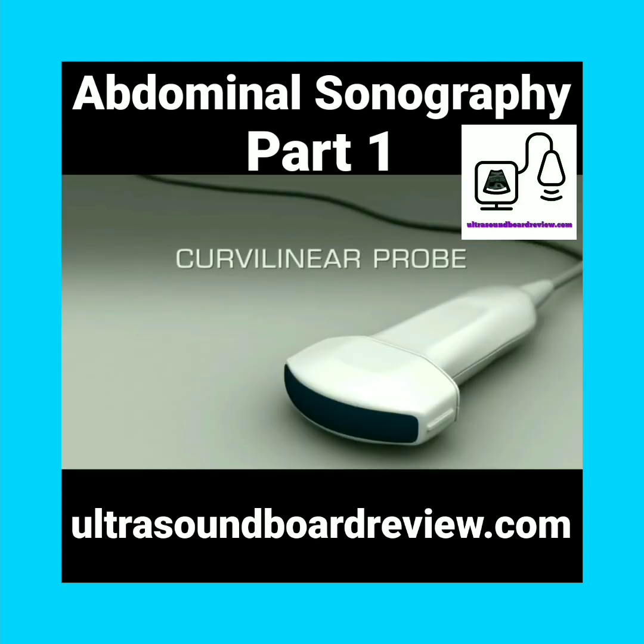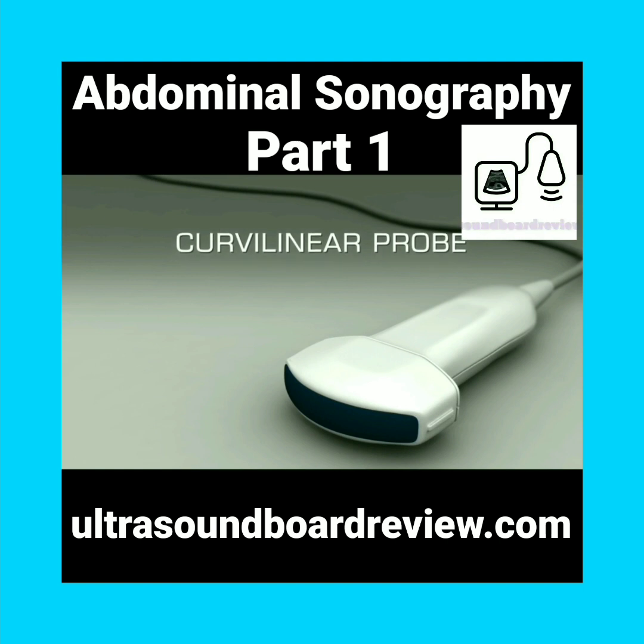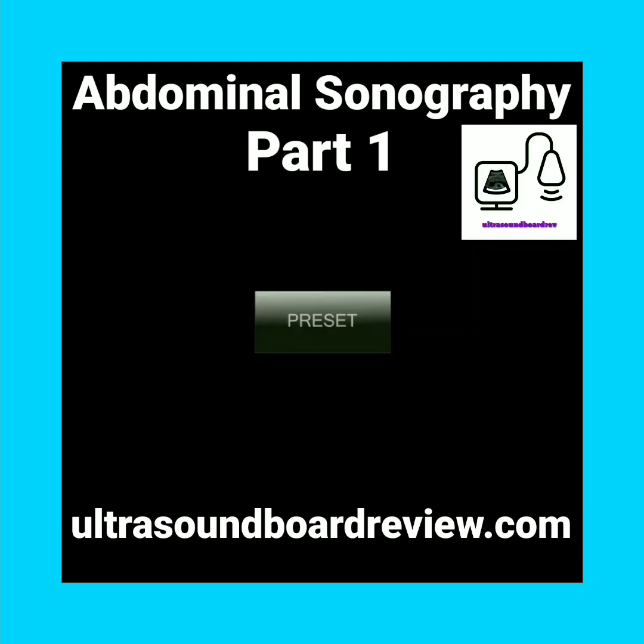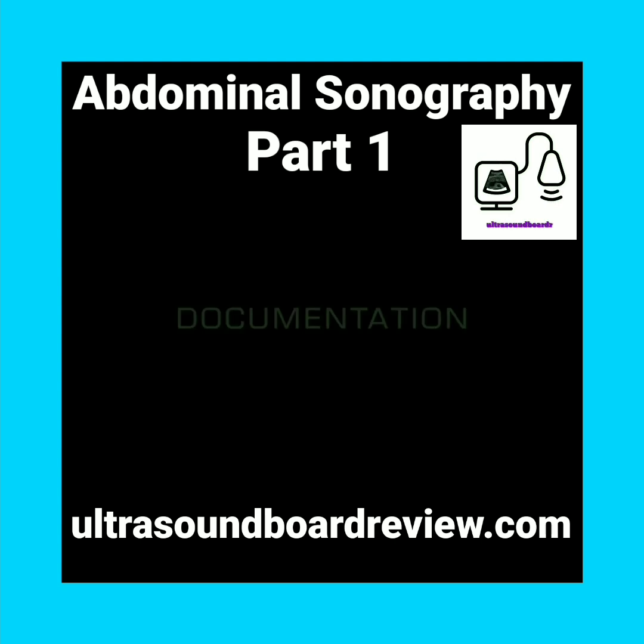The ideal transducer for assessing structures within the abdomen is a curvilinear array probe with a frequency range of 2 to 5 MHz. Select the abdomen preset on the ultrasound device.